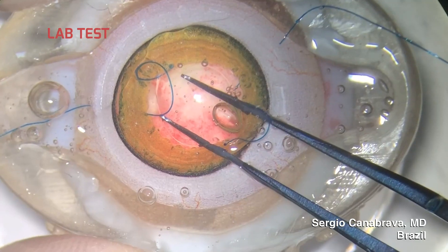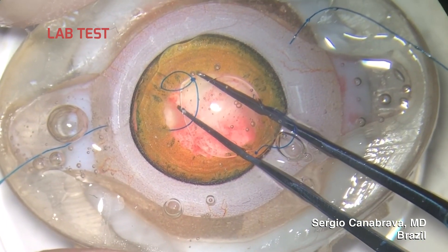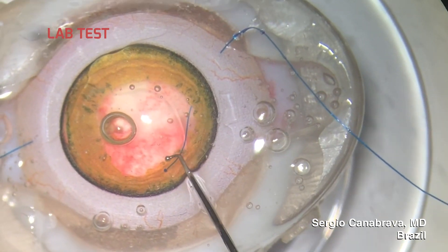Our third step was to perform a lab test to corroborate what we had seen on our previous tests. As you can see here, the four-flange technique, when used with a horizontal axis, seems stable and firm.